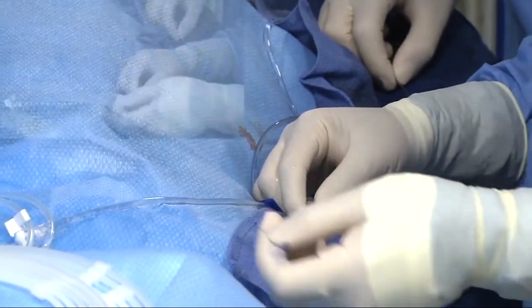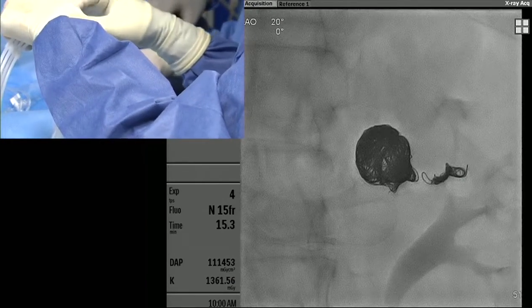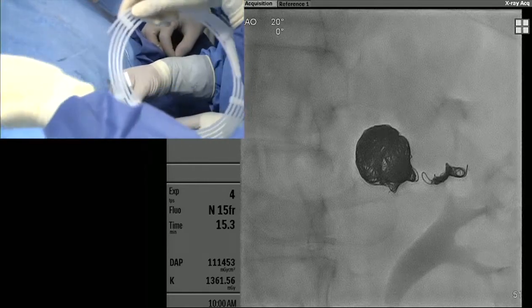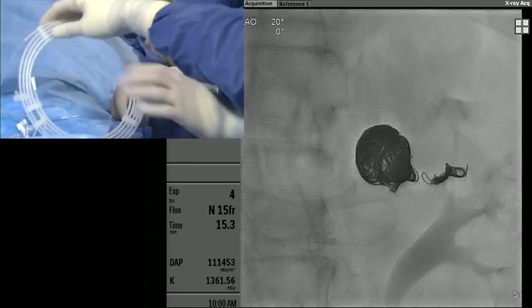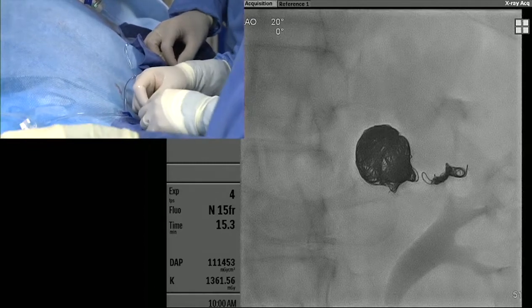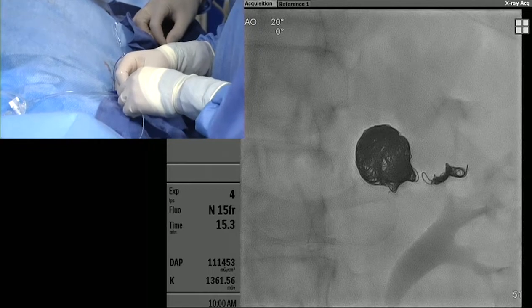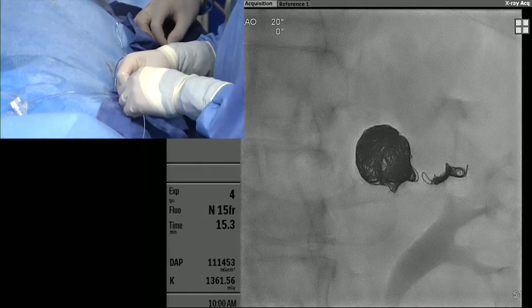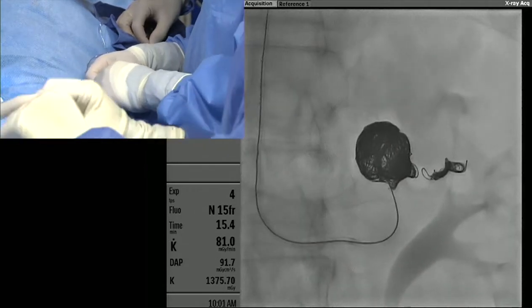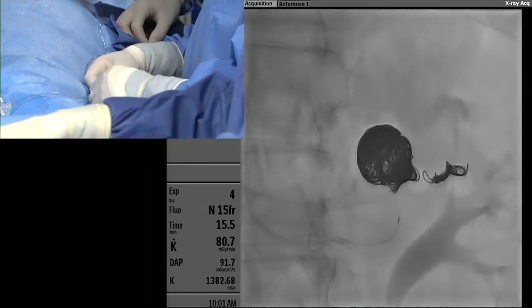This coil is coated with a hydrogel — once it's exposed to blood it expands and fills up space in very unique ways, a little differently than fiber coils. It finds the path of least resistance and fills up crevices better than fibers. You can see the microcatheter marker is right at the inflow now and we're getting into that last little piece of the neck.